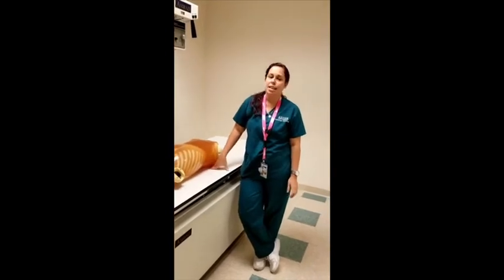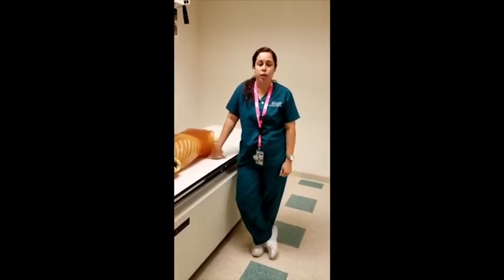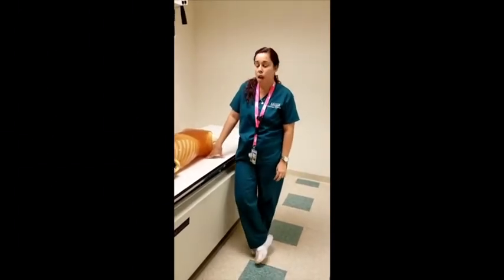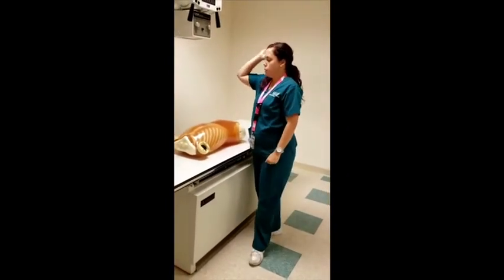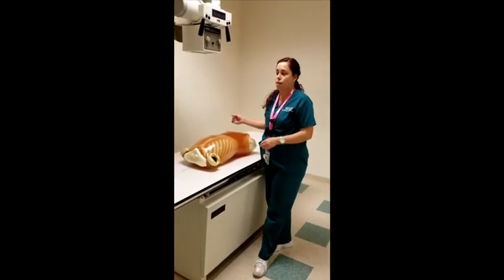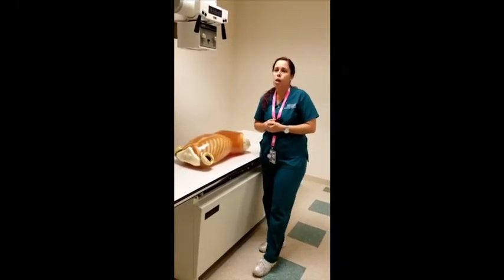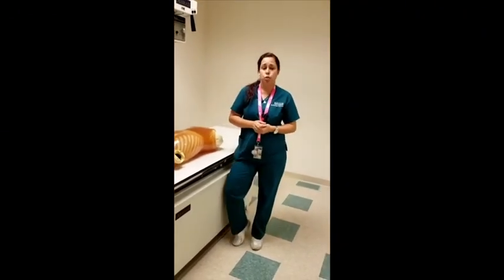Hi, my name is Alexis, and today we're going to talk about scatter and how we can reduce and/or control the effects of scatter on our images. First of all, scatter is produced when X-ray beams interact with matter and then they bounce, typically off the patient and back into the air. We usually try to avoid scatter in our images because it'll produce a low contrast, typically foggy image.